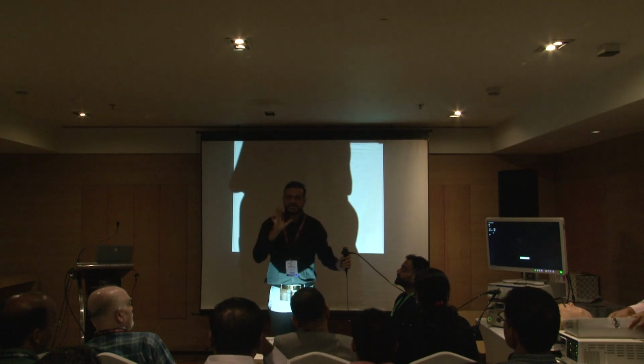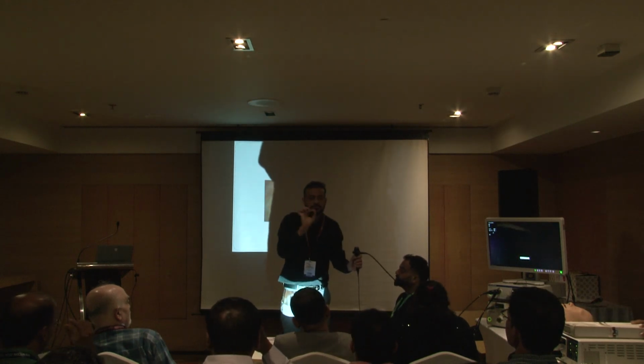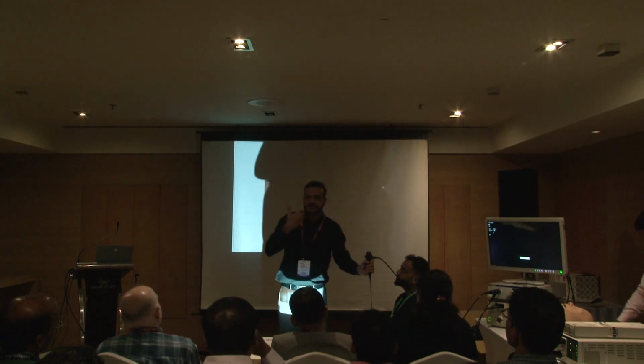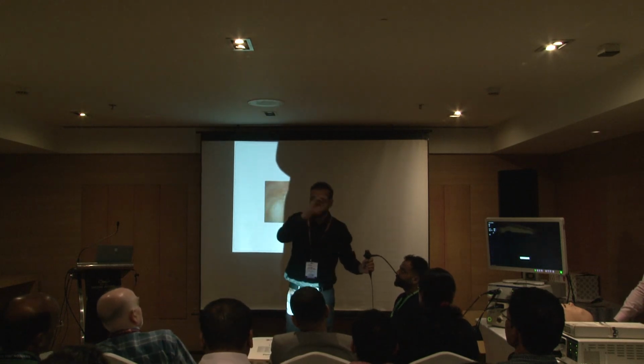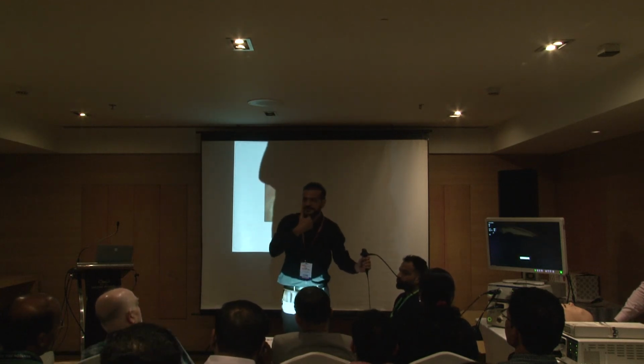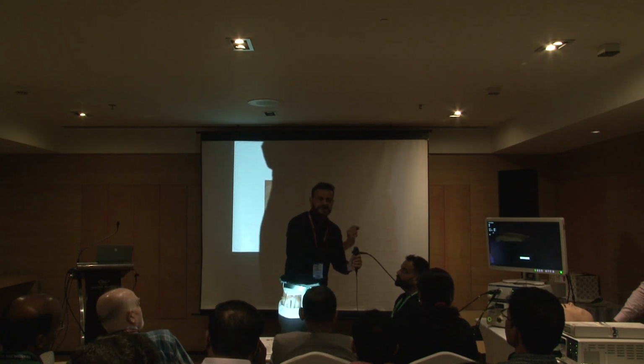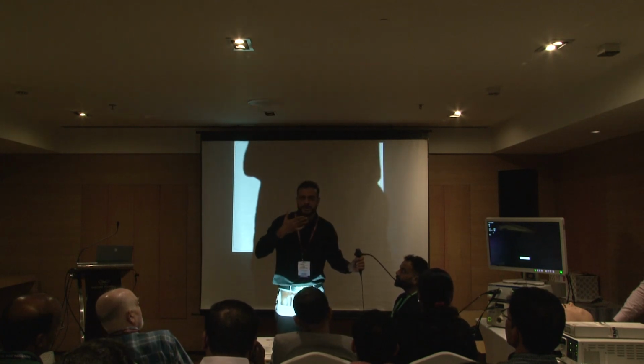So don't spray too much. Before spraying on the patient, when you do it for the first time, spray on your own nose and see how irritant it is. I have done this, and I want all of my students to do a spray inside. It is a very irritative spray. So just one spray in the nose, and tell the patient to hold his breath.